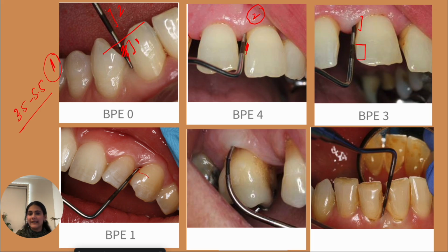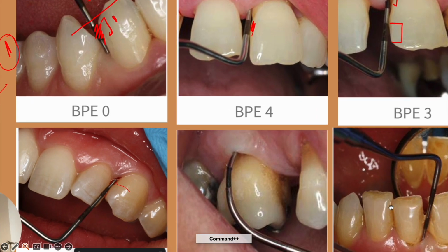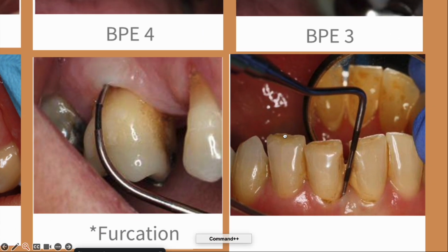Okay, everyone is intelligent. Yes, it is furcation. So we are talking about furcation. That's your Nabers probe. It is curved. It helps us to identify how much is the furcation. Though we are checking with this probe and we can see that there is furcation involved. Now what about this one? Very easy. Okay, I'll zoom for everyone.